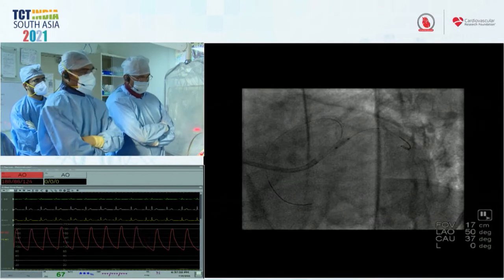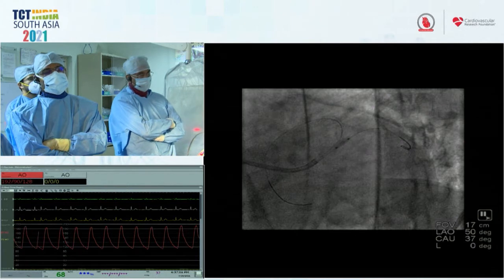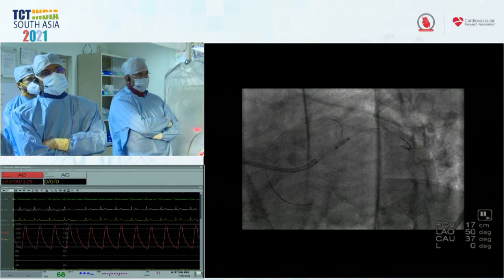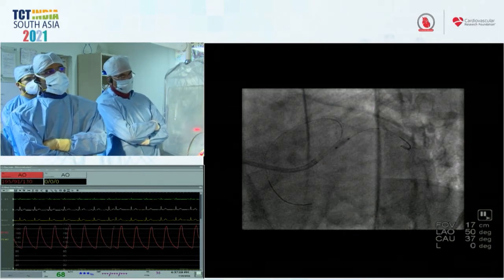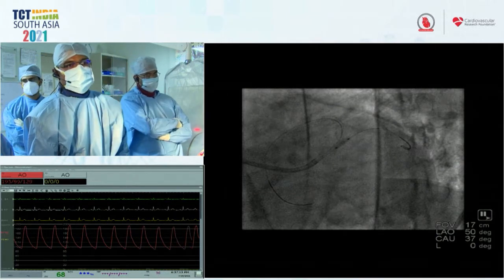If you're able to maintain patency of the ostium, I think you should be able to. The worst case is you may double jail it, but with the maneuver the team did to open the struts gently initially, if you had to recross because you were going to double jail, you'd be in good shape to kiss out or try to bail out.